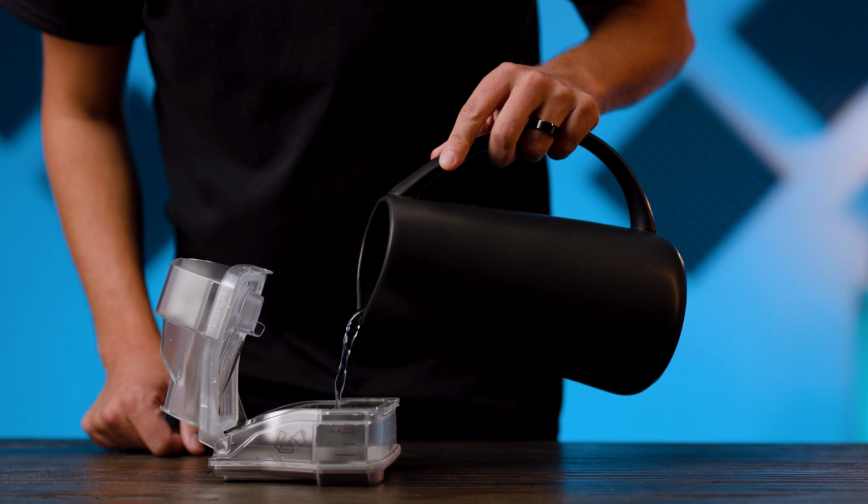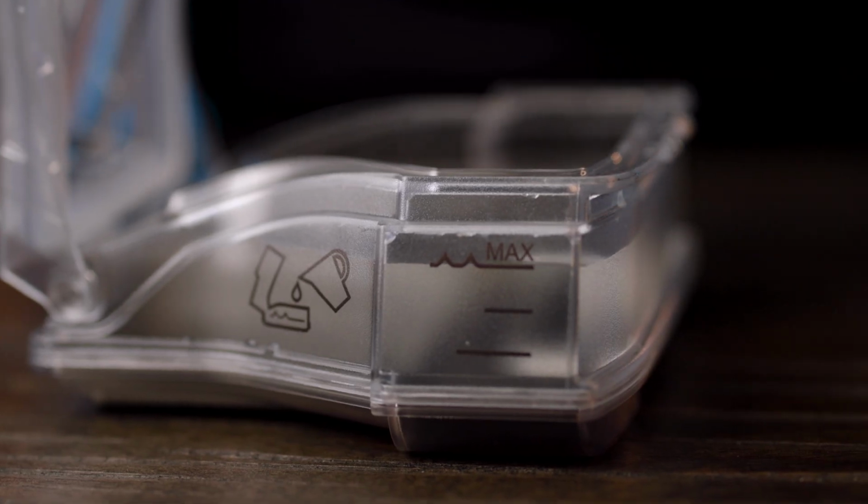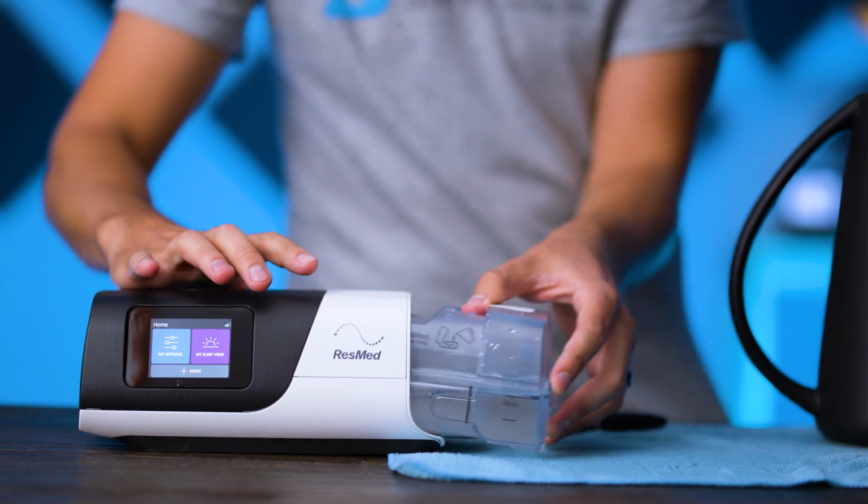If you use a heated humidifier as part of your therapy, the warm, moist air leaves the machine, travels through the tube, and reaches your mask. If the air in the tube is cold, the moisture condenses and forms water droplets in the tube that can then leak into your mask and get breathed in, an unpleasant situation that is called rainout. Heated tubing is designed to prevent rainout.